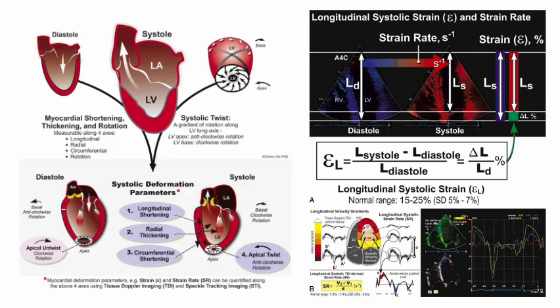Contraction. How? Like a squeeze, is it? Yeah, contraction like that. I think it's like that. But if you remember back in medical school, it's like a towel, and a towel that moves this way, but the other side moves the other way. And it's in the opposite direction, so it's very complex.